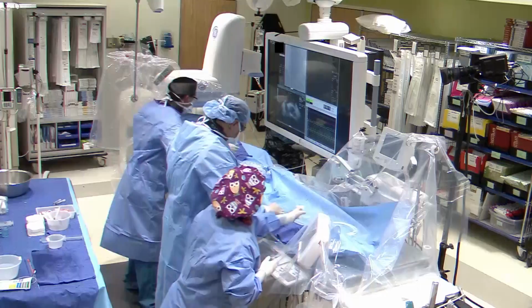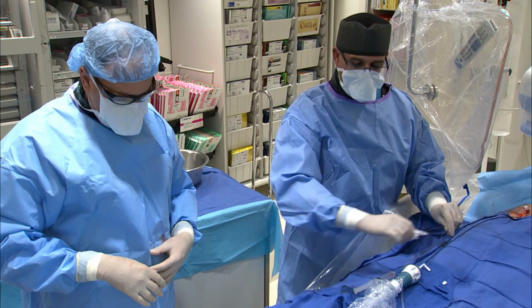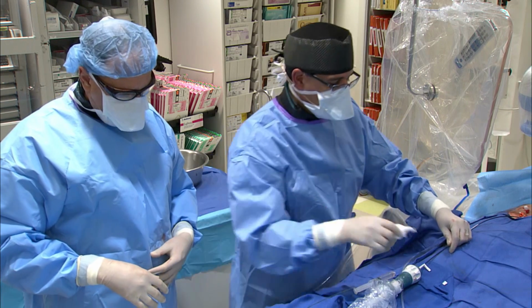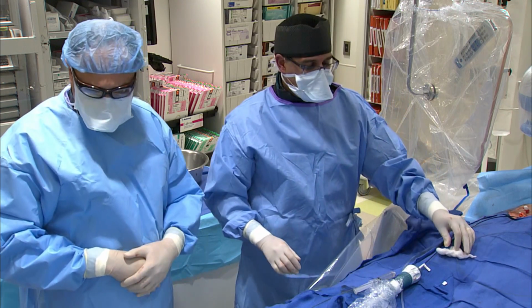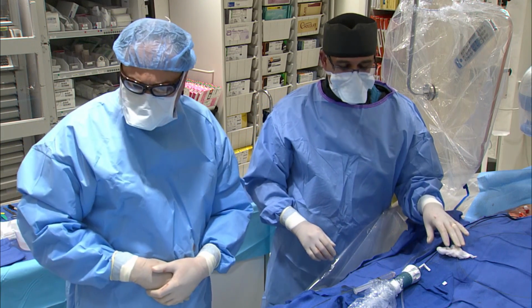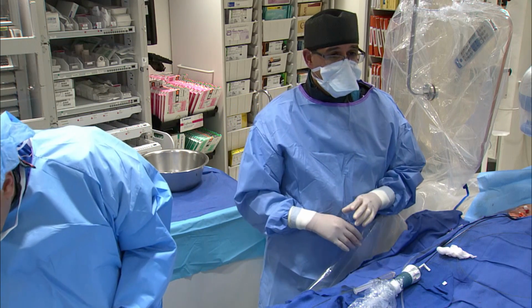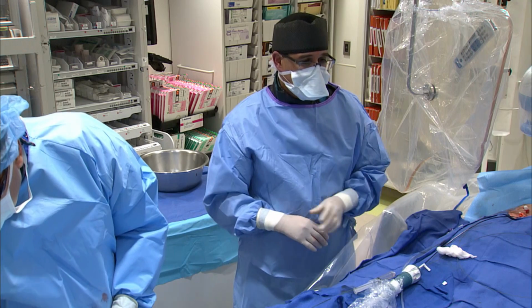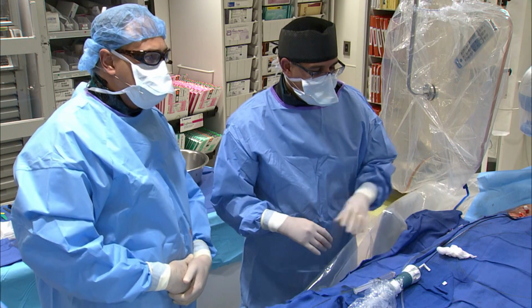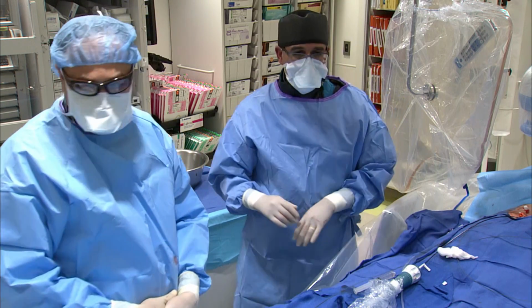So we are going to use a balloon sizing device, and St. Jude has 3 separate balloons. They come in 18, 24, and 34 millimeters. This ASD measures between 10 and 12 millimeters, and usually we do a 10-20 rule. We use an 18 for less than 10, 24 for between 10 and 20, and 34 for above. But we're just going to use an 18 because I think that's going to be enough. So we do this sheathless.